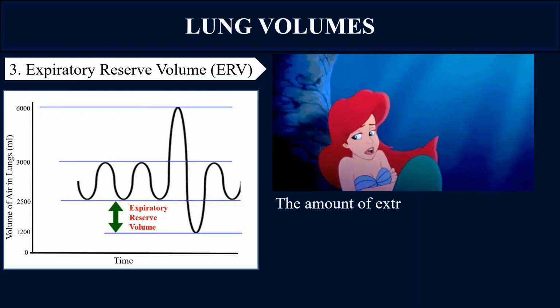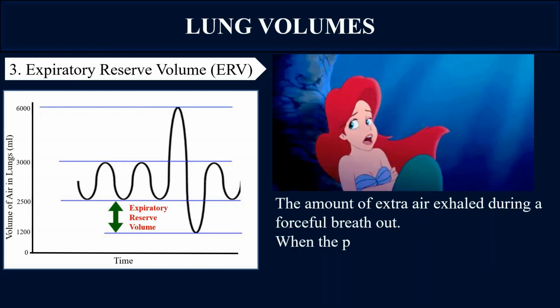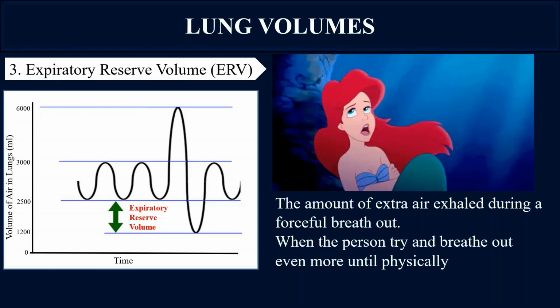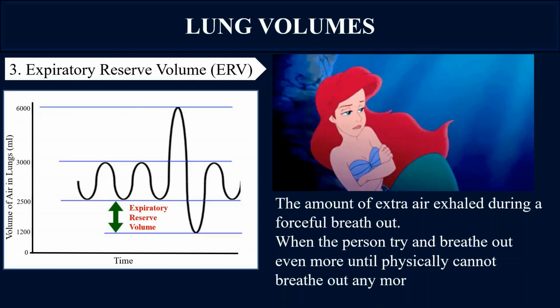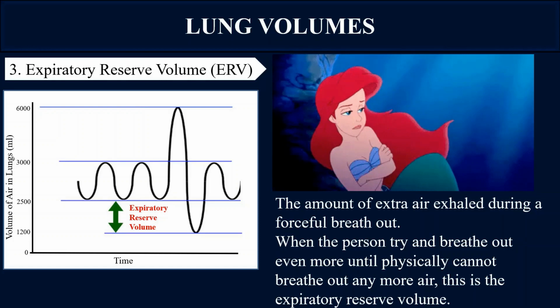What is the expiratory reserve volume? Expiratory reserve volume is the amount of extra air that is exhaled during a forceful breath out, or when the person tries to breathe out even more until they physically cannot breathe out any more air. This is the expiratory reserve volume.